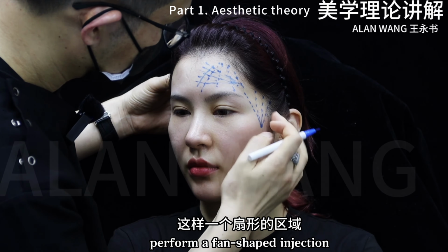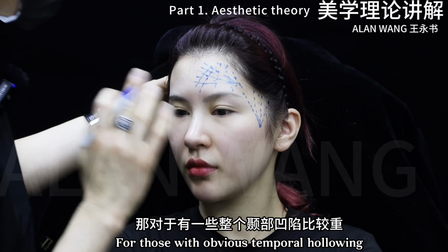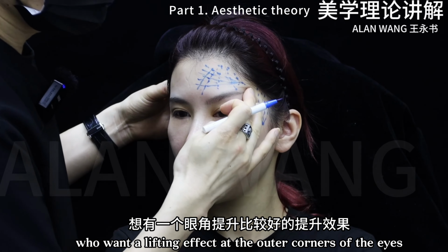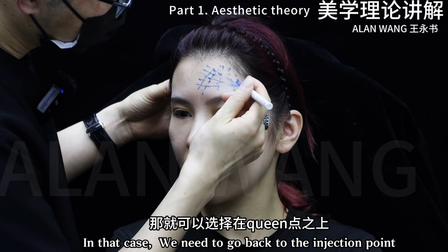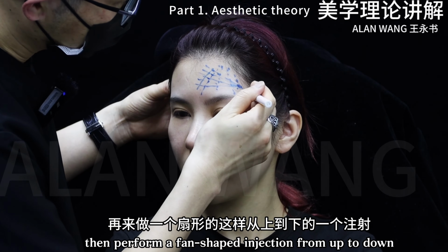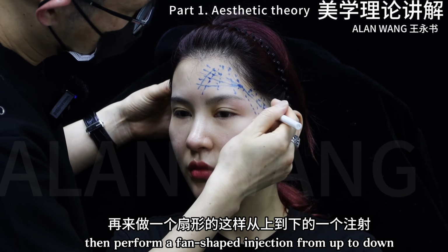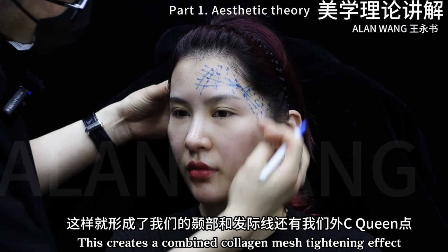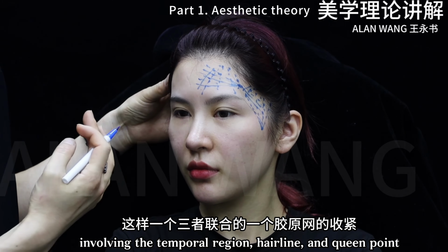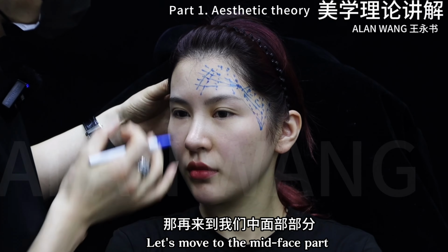Perform a fan-shaped injection. For those with obvious temporal hollowing who want a lifting effect at the outer corners of the eyes, in that case, we need to go back to the injection point 1 cm above the queen point. Then perform a fan-shaped injection from up to down. This creates a combined collagen mesh tightening effect involving the temporal region, hairline, and the queen point. Let's move to the middle face part.